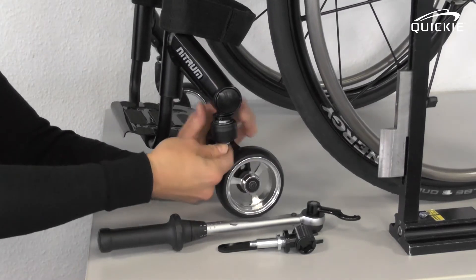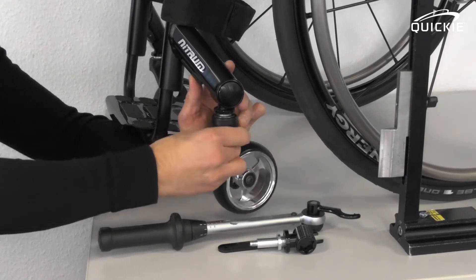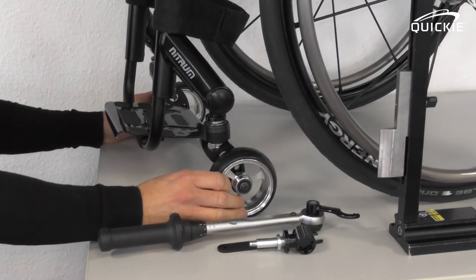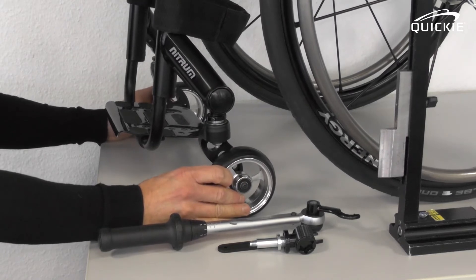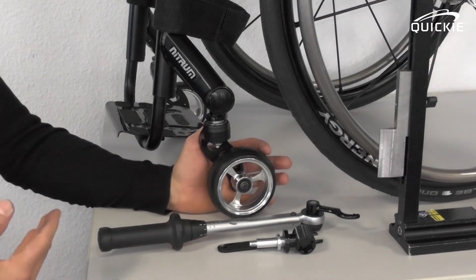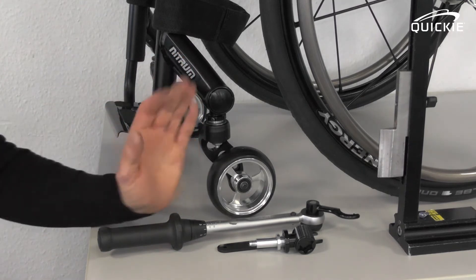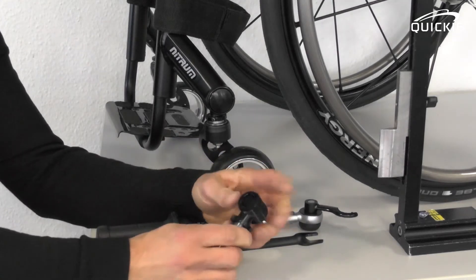Rotate it until all four wheels — especially the caster wheels — touch the ground safely again. Now you have adjusted the height of the caster wheel correctly. You will now have to conduct a second procedure, which is adjusting the lateral angle of the caster fork. Both adjustments are combined.